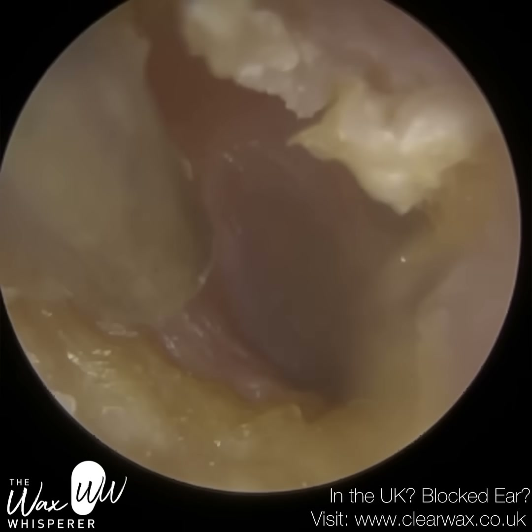I expect that the crystallization process has caused the skin to crimple at certain points. Those crimpled, elevated raised bits then make contact with the canal wall, where you probably get a bit of humidity in between the skin layer and the canal wall, which makes the skin slightly macerated. And then you get those indentations — quite spaced apart, and most geometrically symmetrical. You'll see it in a minute when I really peel this away — even these almost evenly spaced apart marks.